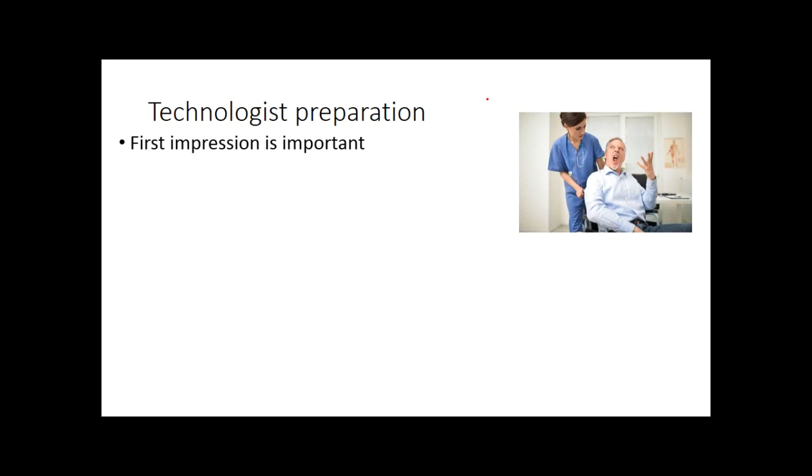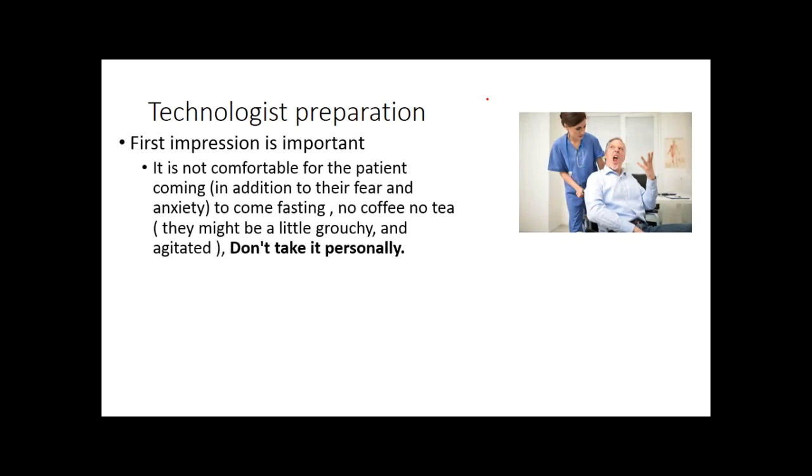Mentally, the technologist should keep in mind that the patient comes to the procedure fasting. They did not have their routine food, breakfast, coffee, tea, smoking. Okay? They might be a little bit agitated and grouchy. So if they become angry, don't take it personally. Don't escalate. Try to find the reason that they are angry and try to resolve it.